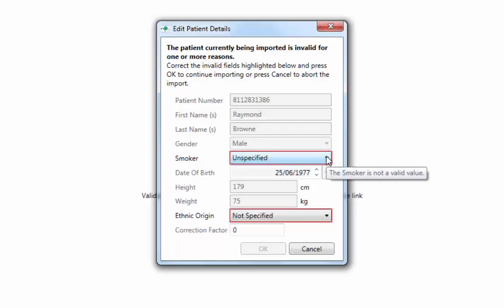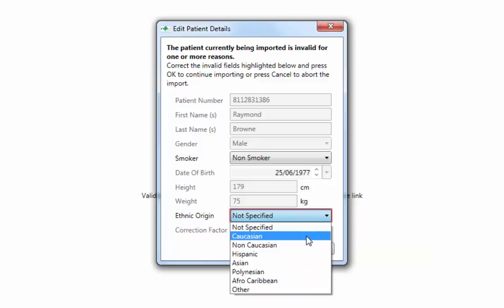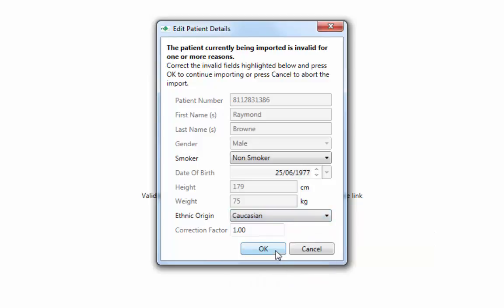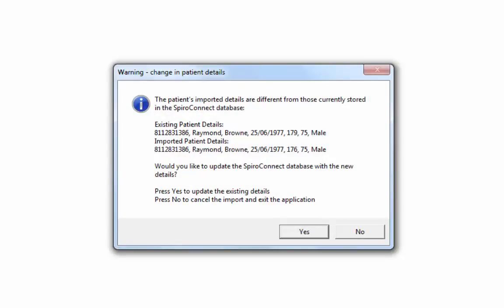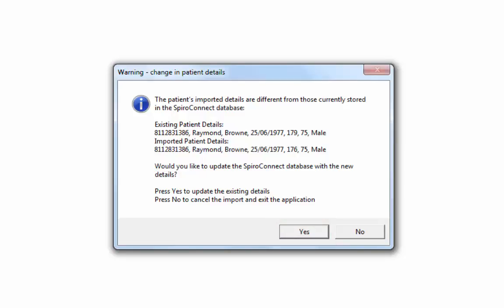If any mandatory information is missing, you will be prompted to complete the missing details. If the patient already exists in the SpiroConnect database and any of the details differ from those stored, you will see a window asking you to confirm the details should be updated. You must answer Yes to proceed with the examination. Answering No will abort the test. You will only see this window if the patient details held in the spirometry database differ from those passed from the clinical system.